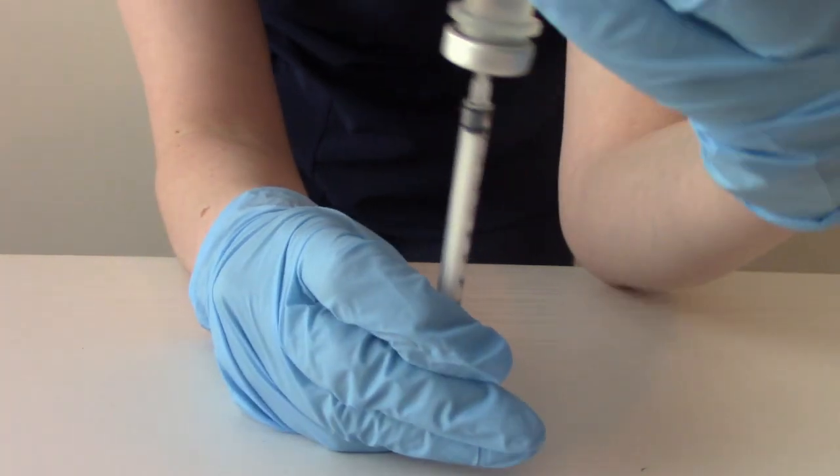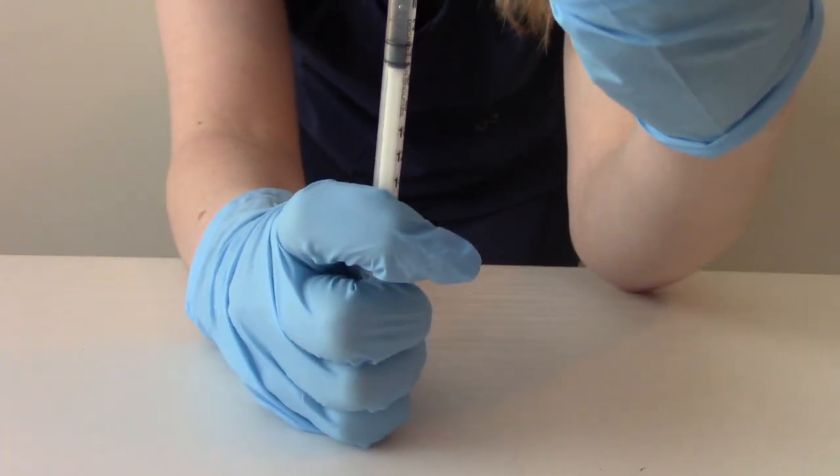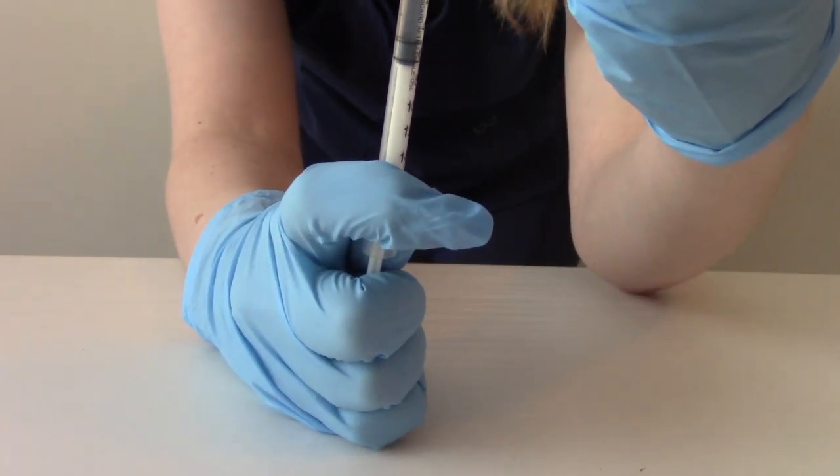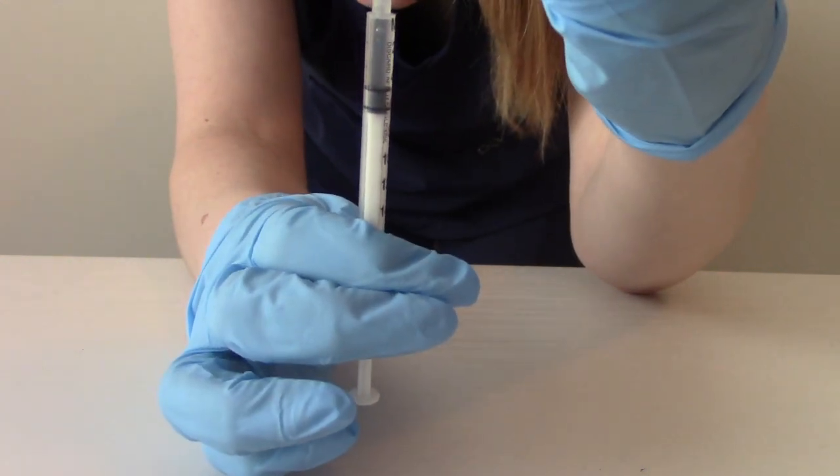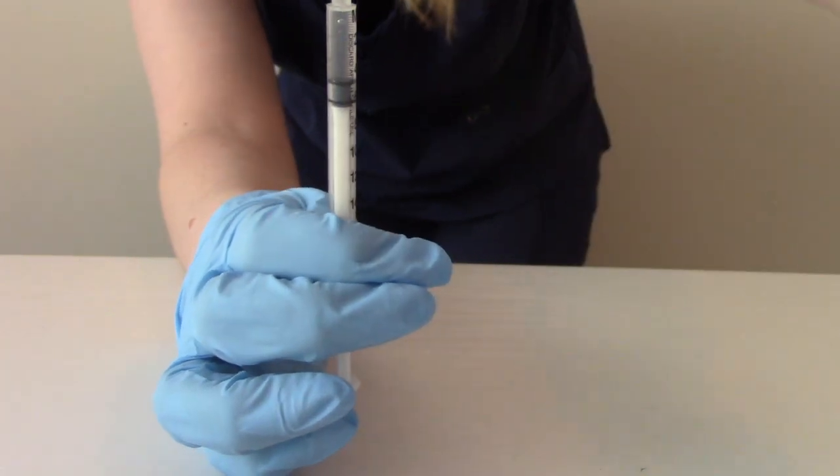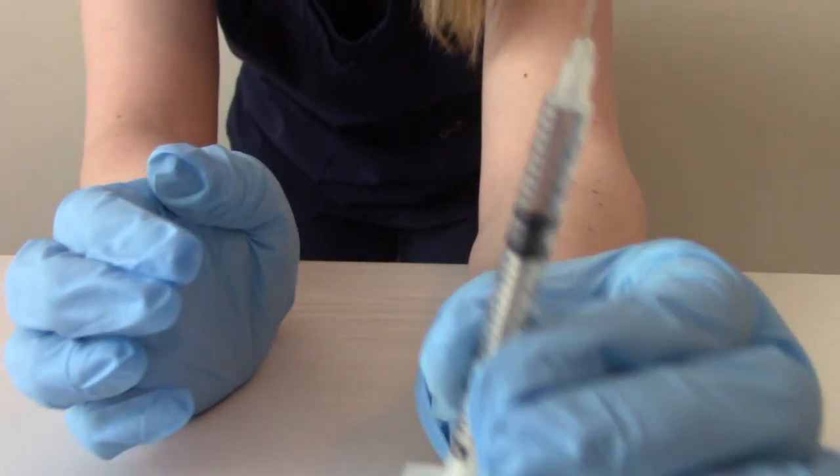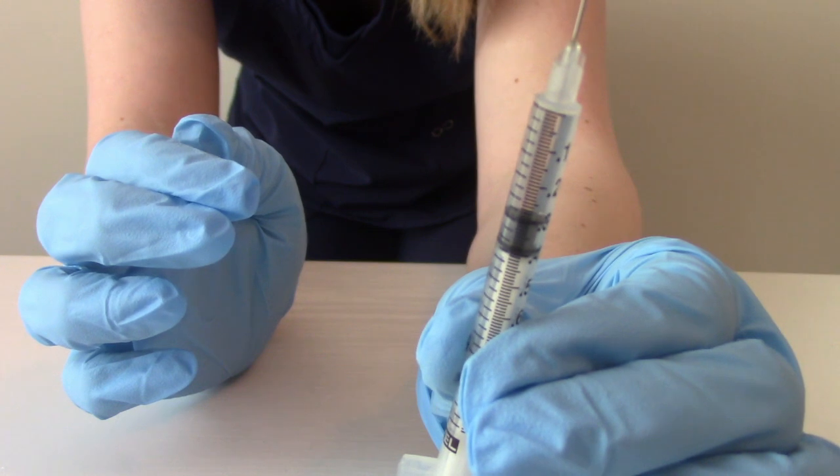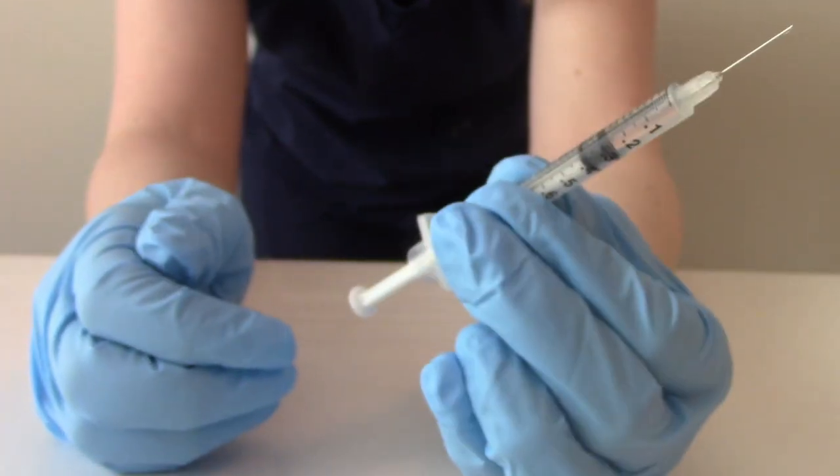And it's best to do this at eye level. You can't see me, but I'm crouching so I can see it and make sure we're at the right place. So here we are, 0.3. Now we're ready to inject this in the patient.